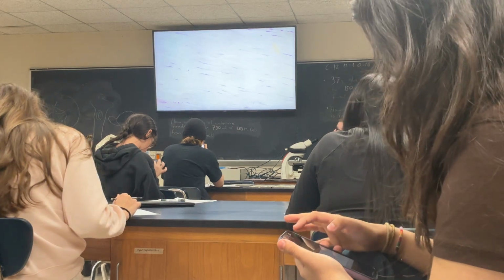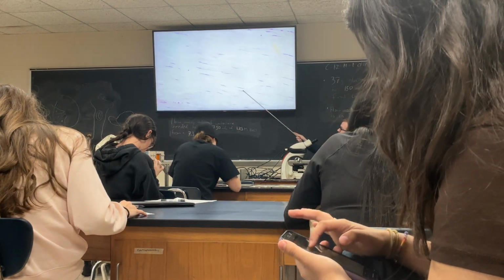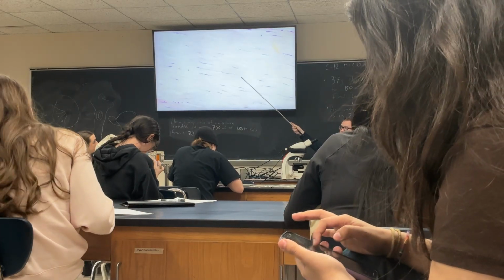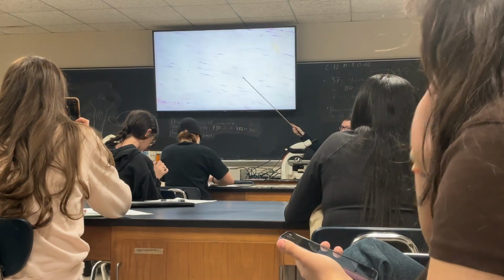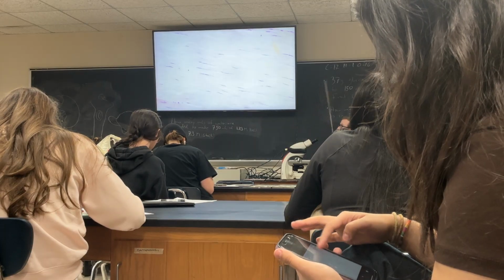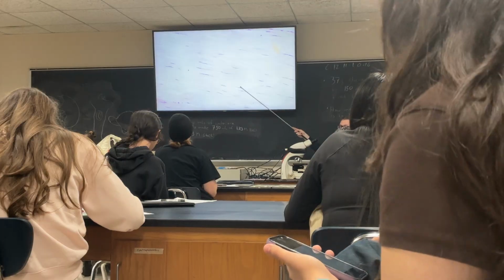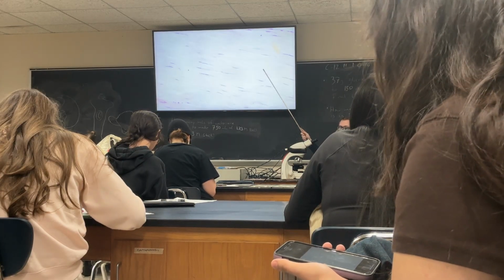So I'm pretty zoomed in. What do we notice about this? We have quite a few cells, right? But there's also a ton of space in between them. That's one of the differences between this and smooth muscle. In smooth muscle, all those proteins are inside the cells. And so to get the same amount of volume, you need a lot more cells, which means you're going to see a lot more nuclei in smooth muscle than this.